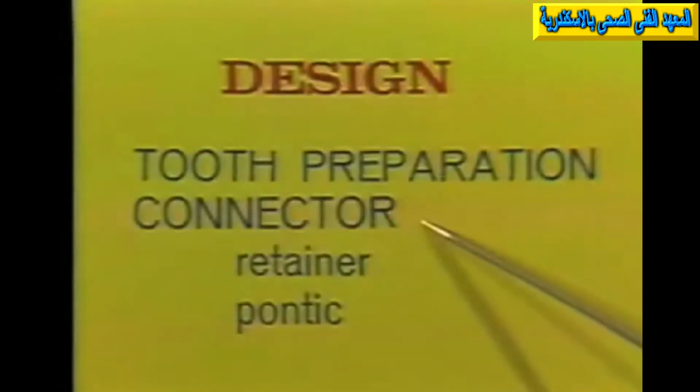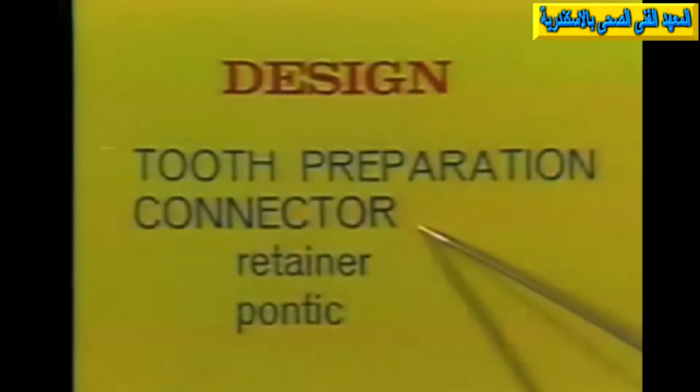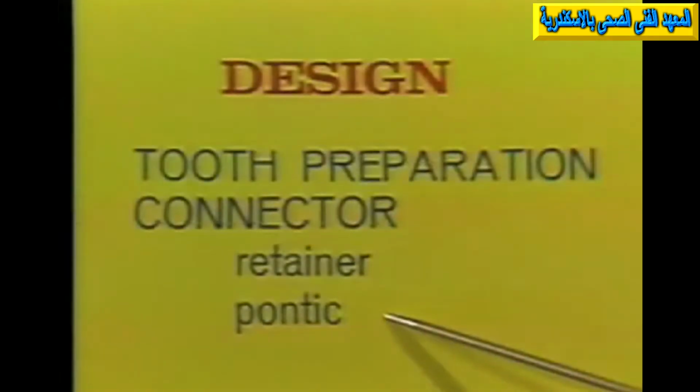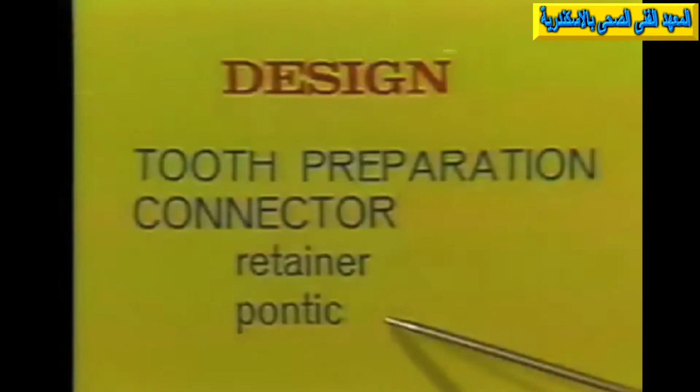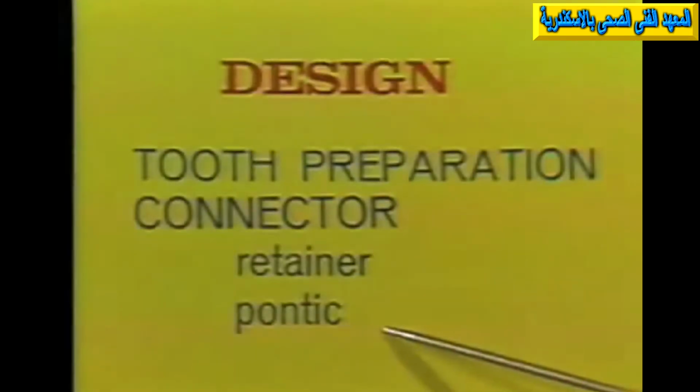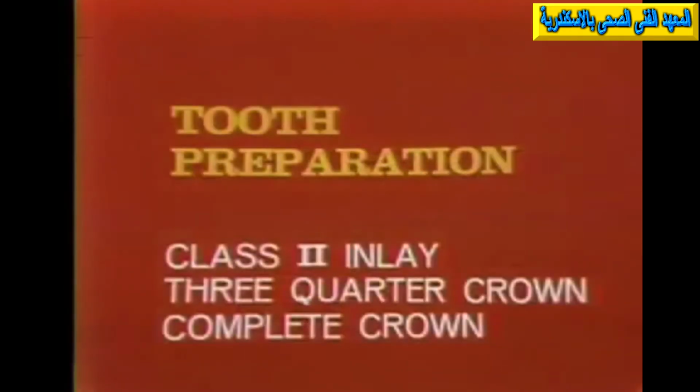As far as the connector itself is concerned, we have to think in terms of the keyway in the retainer and the key itself, which belongs to the pontic. So all of these things are involved in the designing of the semi-rigid connector. Let's take a look, first of all, at the question of tooth preparation.